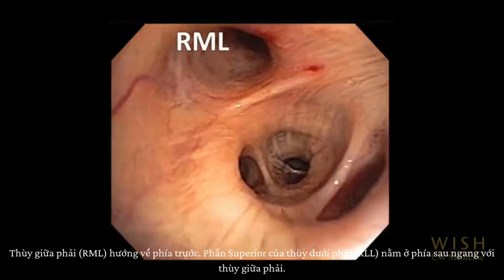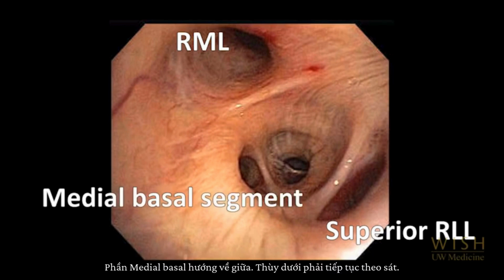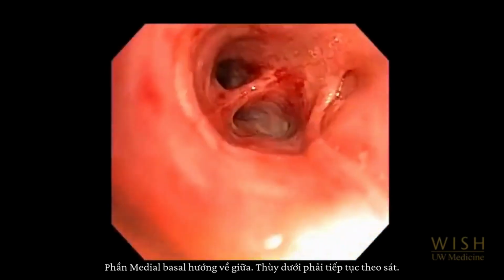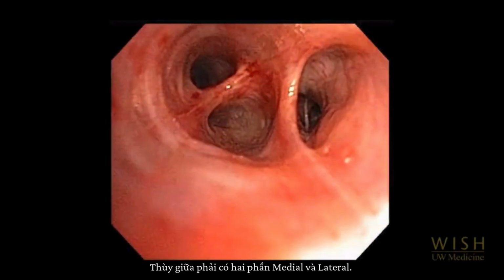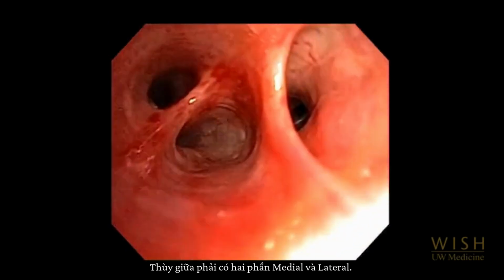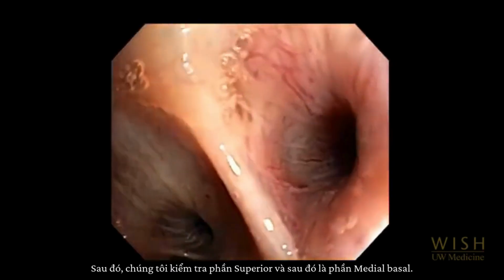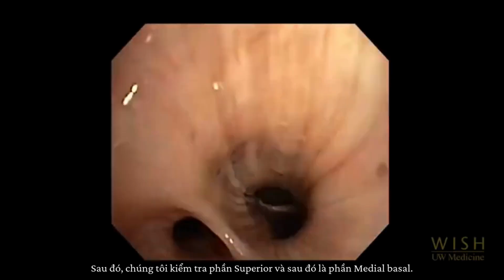The right middle lobe takes off anteromedially. The superior segment of the right lower lobe takes off posteriorly at the level of the right middle lobe bronchus. The medial basal segment takes off medially. The right lower lobe bronchus continues caudally. The right middle lobe has 2 segments, medial and lateral. We then inspect the superior segment, and then the medial basal segment.